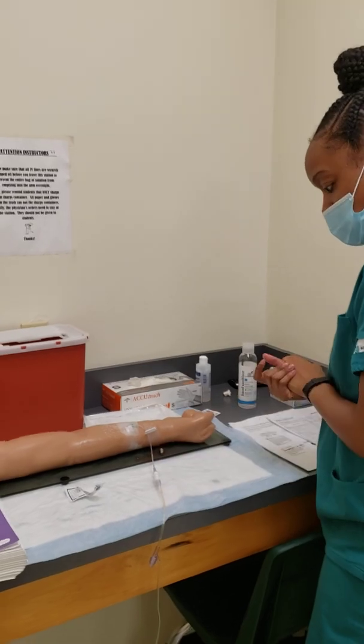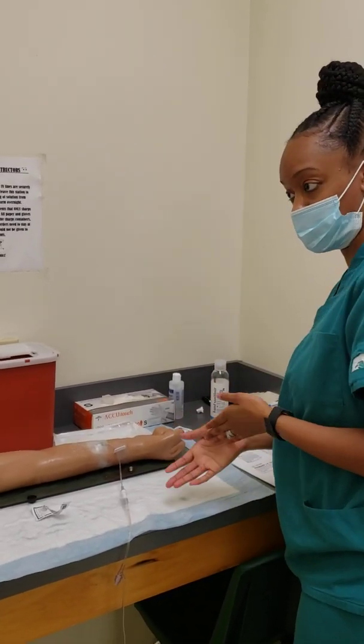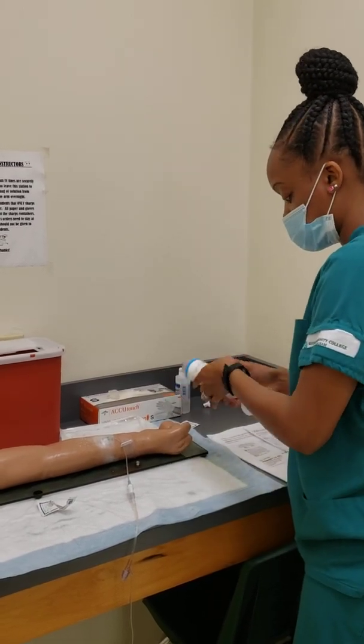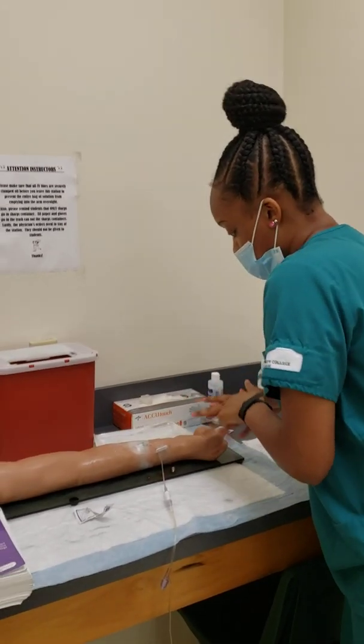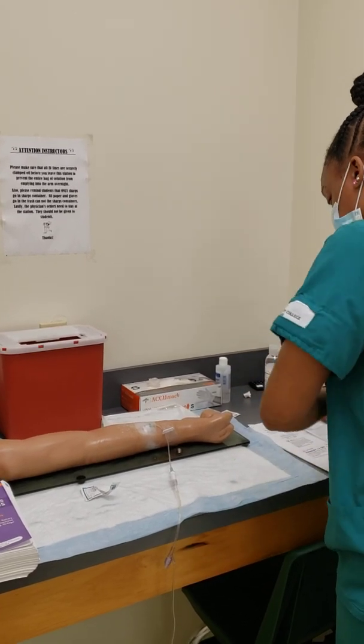So I've given my medication, and I will come back to the room to stop my medication. So I'll go ahead and perform hand hygiene, check my patient's name and date of birth. Can you tell me your name and date of birth? Okay. All right. Can you tell me if you have any allergies? Okay. She says that she doesn't have any allergies.